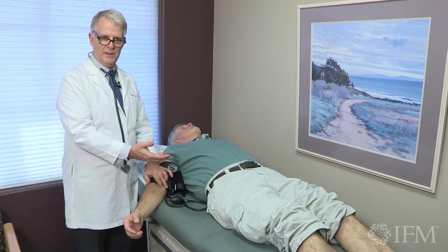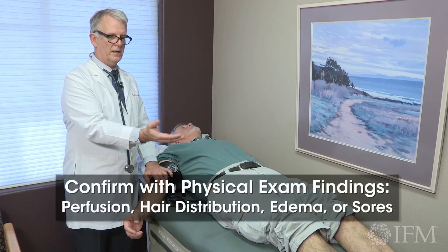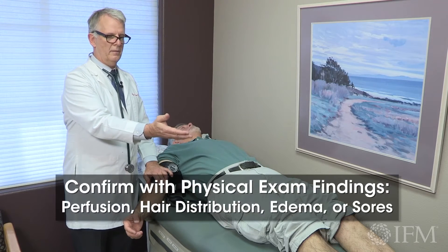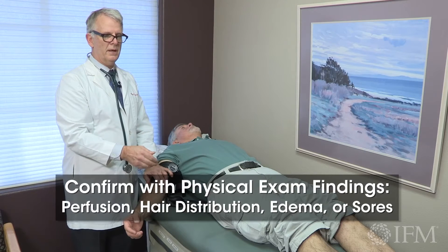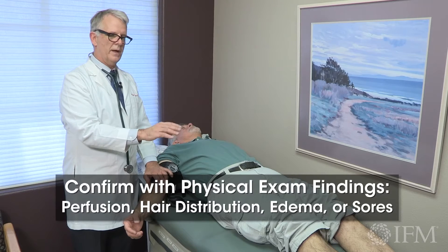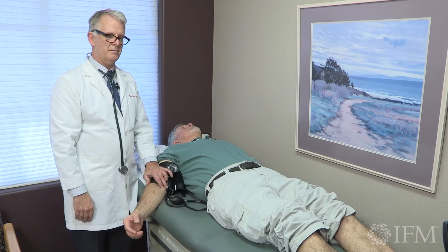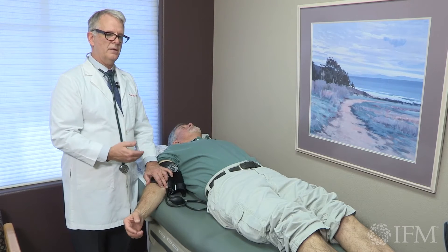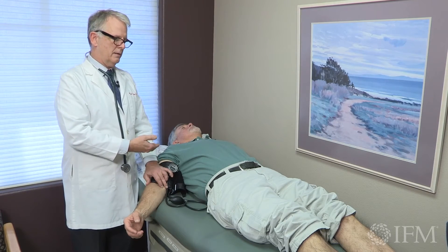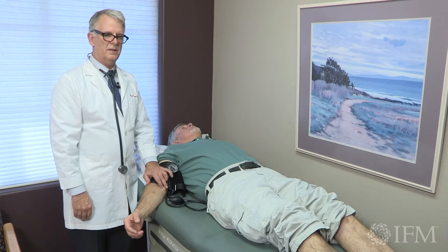There's no indication by numbers or calculations that he has peripheral vascular disease. You've already seen that he has good perfusion and color of his feet, he has really fine hair distribution, and there's no indication of edema or sores or any other issues that would suggest peripheral vascular disease. So the ankle arm or ankle brachial index in this patient is really consistent with his clinical exam.